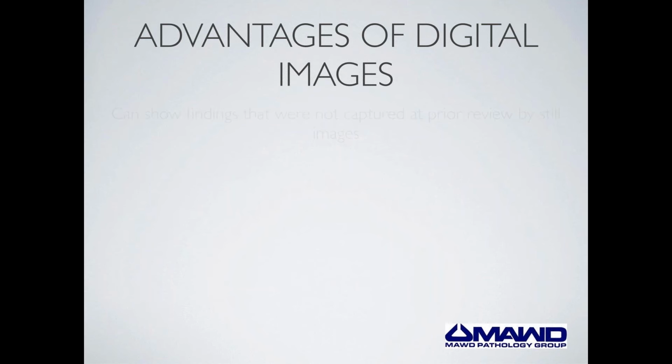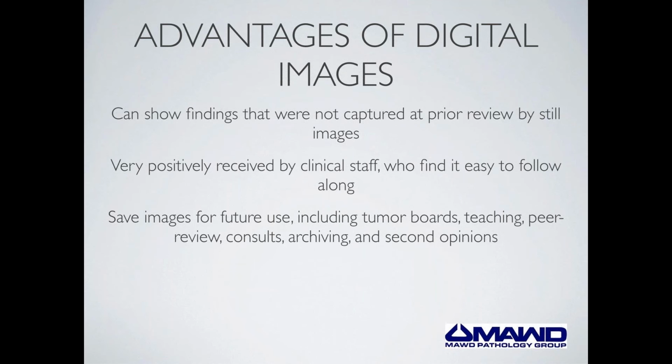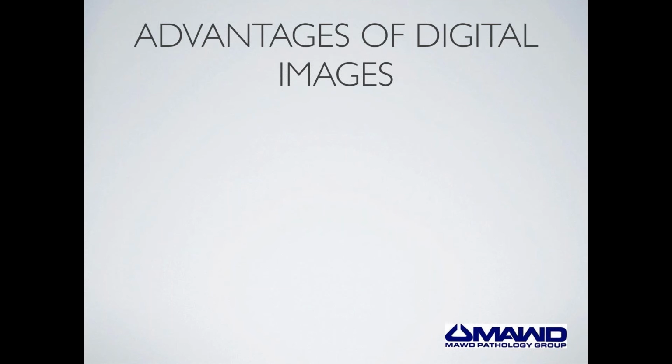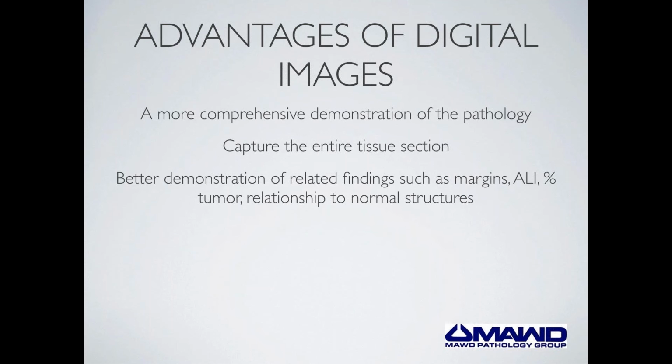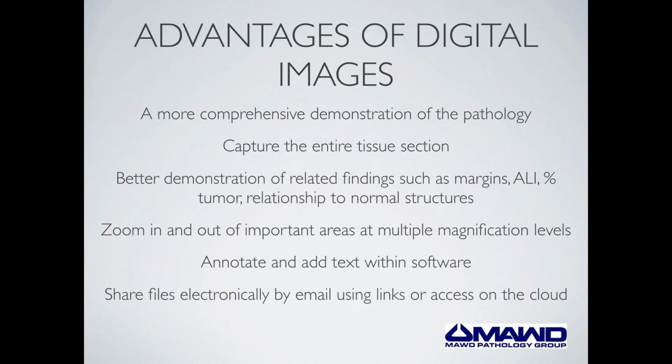Thank you. Now, digital pathology, in my opinion, is like moving from your old rotary phone to the latest model of a smartphone. You can very easily scan all the relevant glass slides using the scanning software that is provided by ViewsIQ. And this software lets you scan the entire tissue section or sections, if you have levels, enabling a very comprehensive demonstration of the pathology. You simply, and for most of us very intuitively, move between magnifications or areas of interest with the mouse or the keypad.